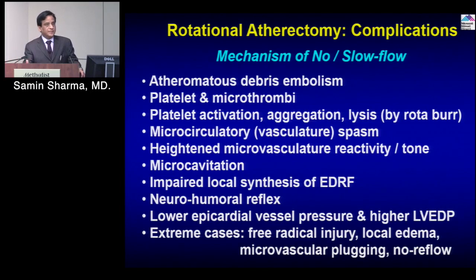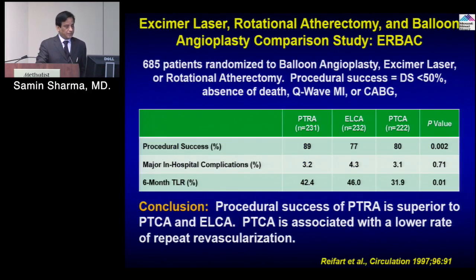You may use any adjunct devices. Surgery is not an option for these cases. So the idea should be to decrease the slow flow as much as possible.